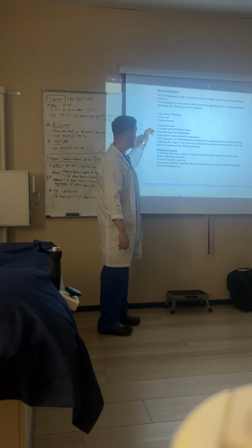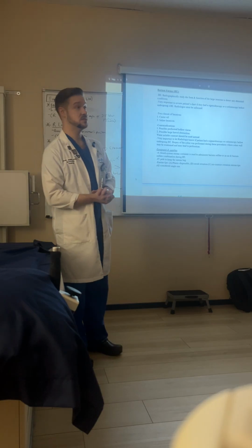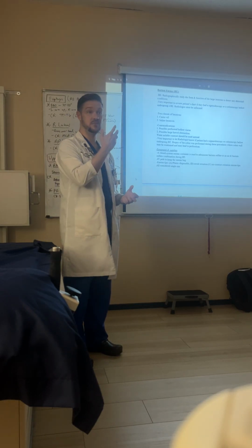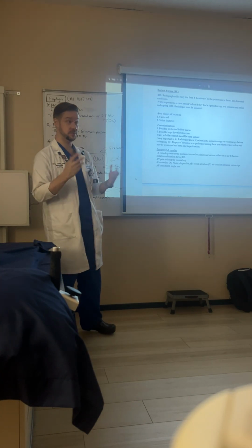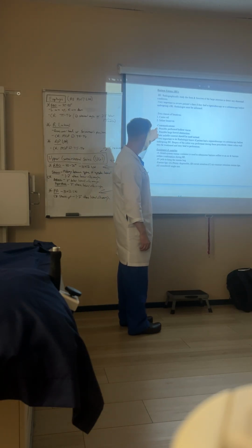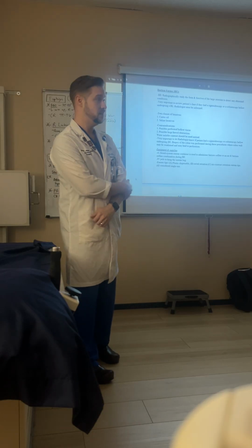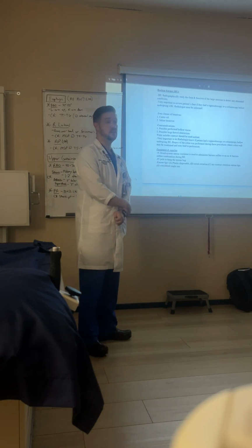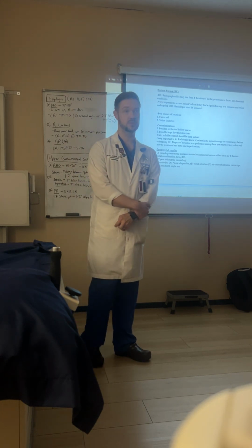The other main reason why we don't want to give them contrast if they have a large bowel obstruction is we could cause a perforation. If we start putting stuff into an obstruction, there's only so much pressure that can take before something has to give somewhere. So in the case where we're concerned that there could be a perforated hollow viscus, we're going to use iodinated contrast media again. Very important to let the radiologist know if the patient had some kind of scope procedure recently, or if a biopsy was performed.